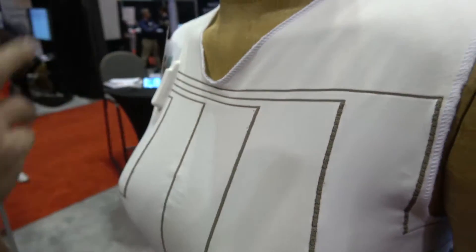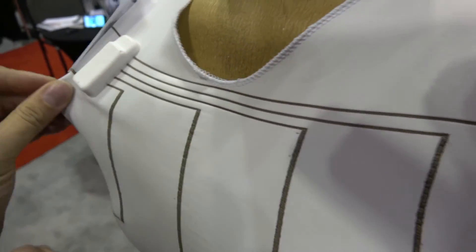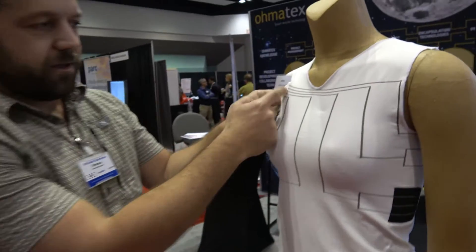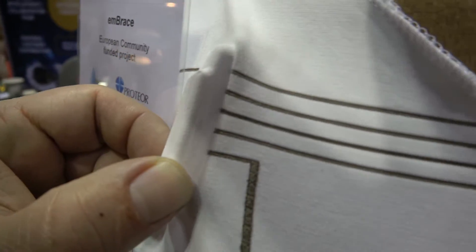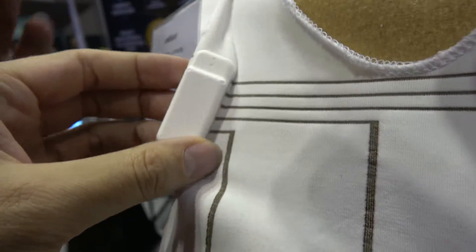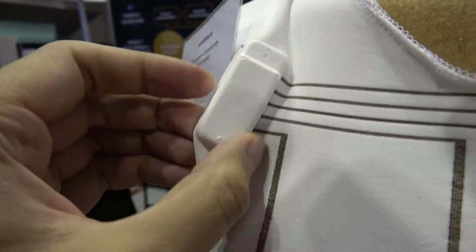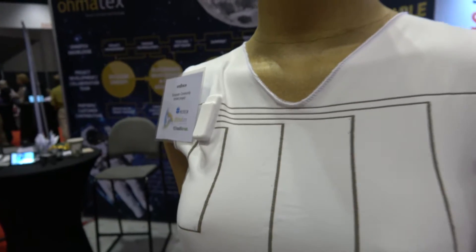Then you cut out for the arms and neck and mold on the electronics. Is this reliable? Are good measurements coming out of this? It is for sure — the electronics are molded directly onto the conductive yarns. It's charged wirelessly. It's a PCB with a Bluetooth module, a battery, and a wireless charging system, and it communicates over Bluetooth.